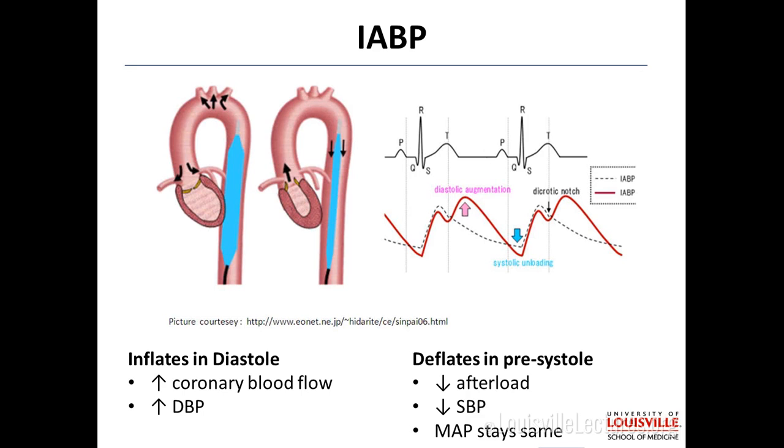You don't want the balloon pump tip up here. If it's going around the curve, it's not meant to do that, so you're going to cause trauma to the aorta. Also, if it's too low, the balloon pump, depending upon the length, might cover the renal arteries. If you see hematuria in a patient with a balloon pump, you've got to get a stat chest x-ray and worry that the balloon pump is too low and you're actually compromising renal blood flow. They end up with decreased urine output and hematuria. So those are two important things to check every day on these patients regardless. Even if you don't think it's moved, everybody gets a chest x-ray.